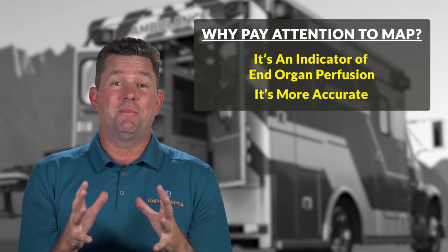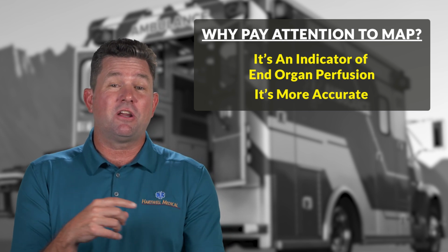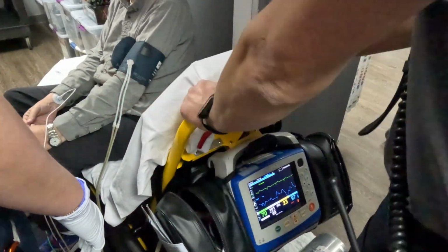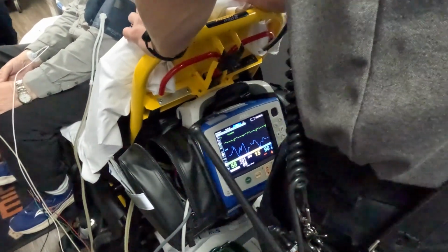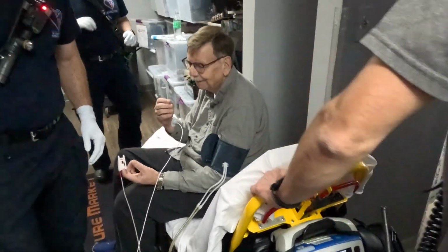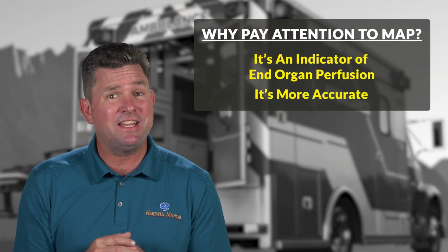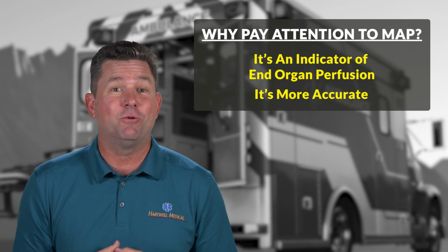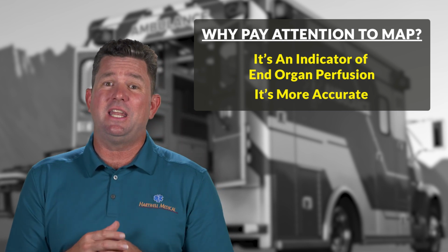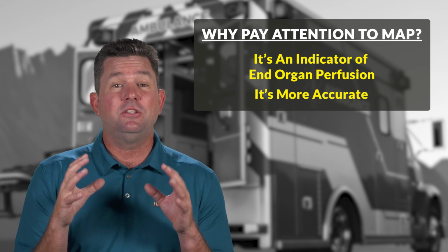I want to tell you something about that monitor or calculated blood pressure. That monitor that you're using or that auto cuff that you're using, it calculates MAP first. And then it extrapolates the systolic and the diastolic pressure. So if you have concerns about the accuracy of an auto cuff or an automatic blood pressure, the MAP should be the first number that you look at. And let's face it, you should be taking at least one manual blood pressure anyway. If that manual blood pressure matches closely to what you're getting on your auto cuff, then you can accurately also pay attention to that MAP and use it clinically.